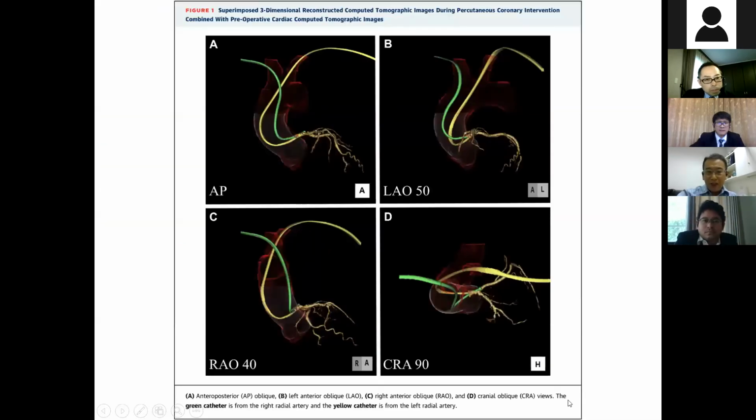In this picture, they put a composite picture combining the approach of the same catheter from the right radial artery and the left radial artery, merged into the same picture. And this is a computerized tomogram to show you that from the left and right, the catheter attaches to the wall differently, and the direction that points to the target artery will not be the same.